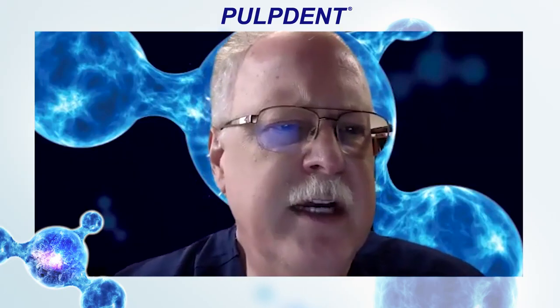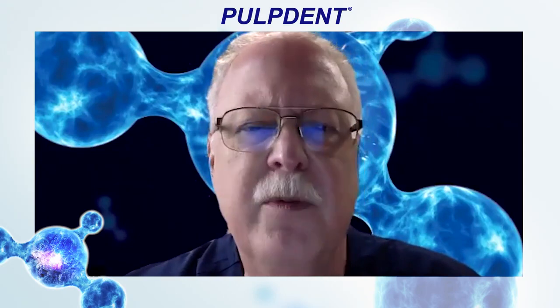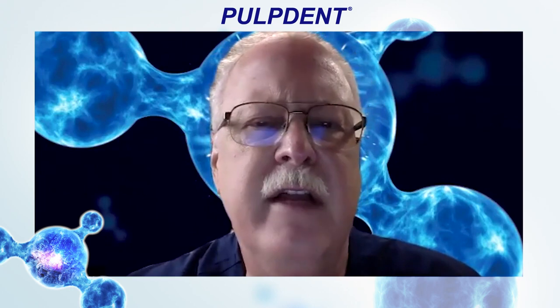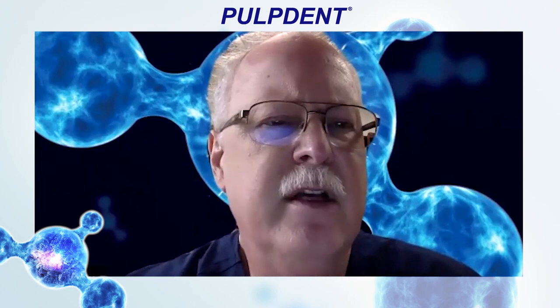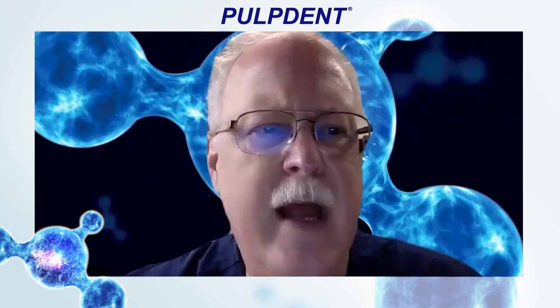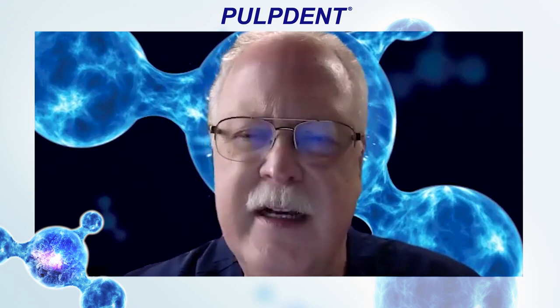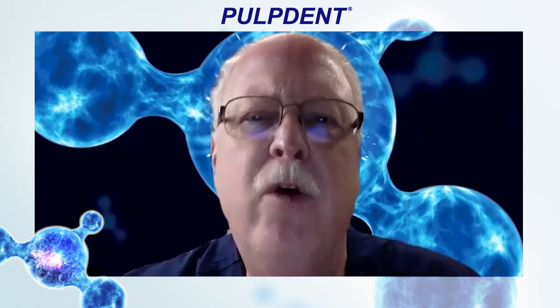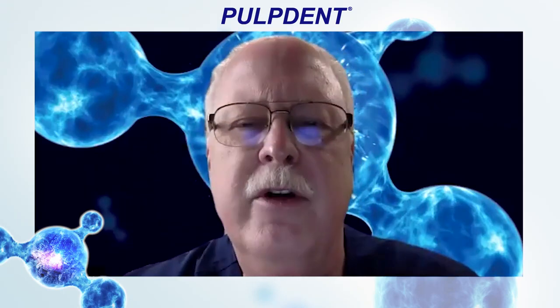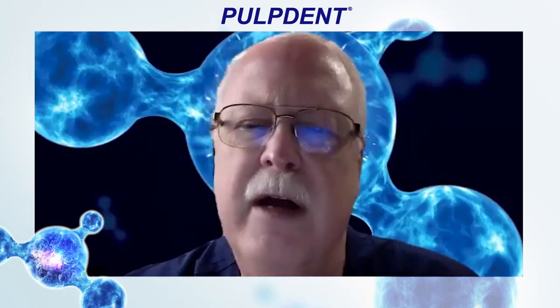So think about this for a second. We've been talking about bioactivity in very relative terms for years in the field of dentistry. Most dental materials are inert. They don't elicit any type of response when placed in the oral cavity. Now, we have materials that, as we'll discuss, will make quite a difference in the availability of certain ions to help nourish the teeth and help preserve the natural dentition throughout life.